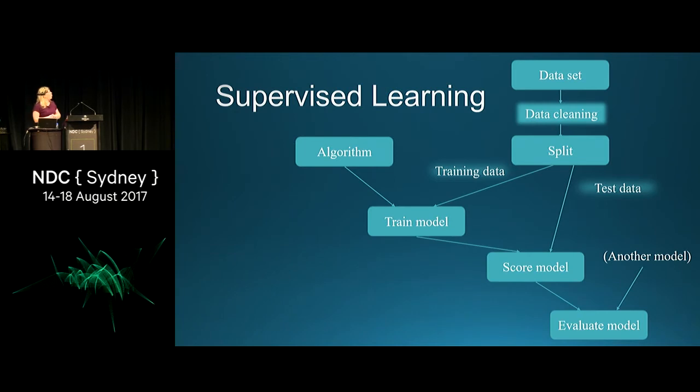So I used that. Here is one template you can use if you're looking at Azure Machine Learning. It's a web-based tool, so you don't need to download a lot of stuff. You drag and drop little modules and string them together to create a data flow. In this case, you take a data set like this, then do some data cleaning, and I used various modules for that. Then in the machine learning step, we split our data. The reason is, if I have this nice labeled data set of EEG data and whether he's telling the truth or lying, and I fed it all of that data, and then went back to see if it worked, and took some of that data and said, OK, for this EEG pattern, is he telling the truth or lying?